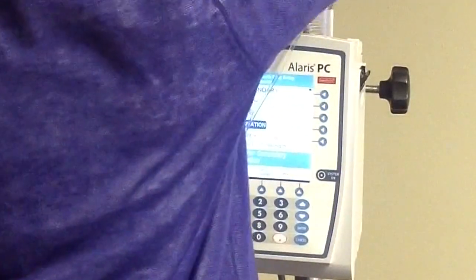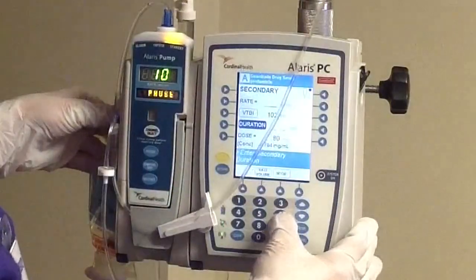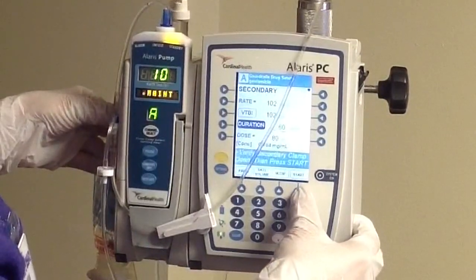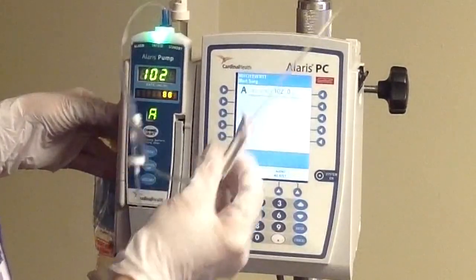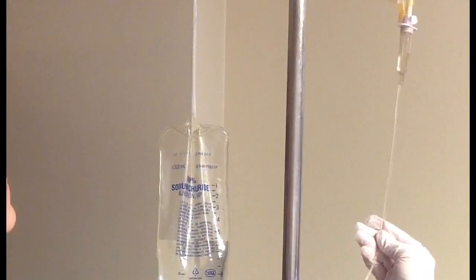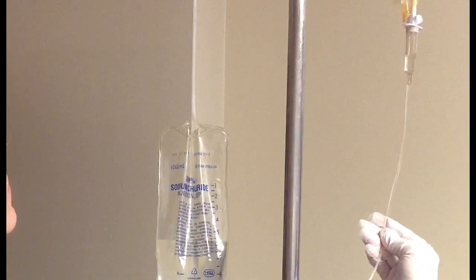The duration off the bag is telling her 60 minutes, which will calculate her rate for her, and she can hit start. Roller clamp is open, and she's going to wait and watch for 3 drips in the chamber before she leaves the patient's room.